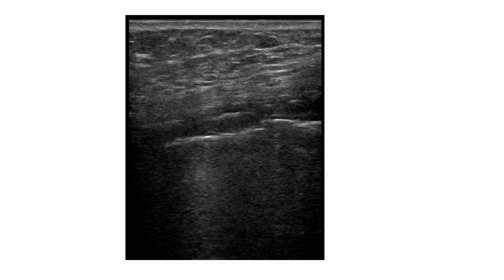What I wanted to point out here is that sometimes it can be a little bit difficult. As you can see here, you see some bright, very small, but still bright reflector with some reverberation artifact behind it, and also here. But the difference is this is not an EPSS because the peritoneal stripe is right here. This is just some air inside the bowel.